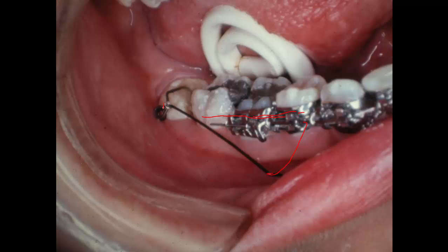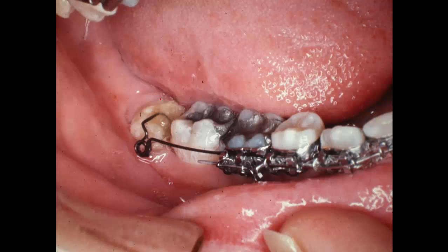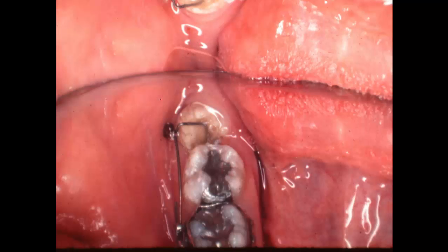The mechanical advantage there is the same as if I had bonded this tube on the side of the tooth there. See? Now here it is, another view, and I laid the wire on top of these teeth. And it's going to push down on the molars and bicuspids over here, and that's where you get the force that picks this tooth up and pushes it. It raising it up, it rotates on that point down where the roots are in the bone, and the crown of the tooth actually backs up.